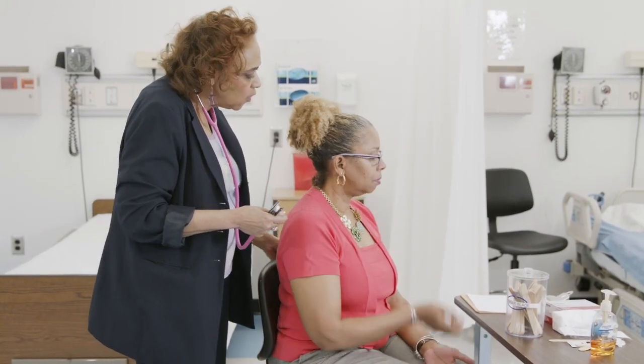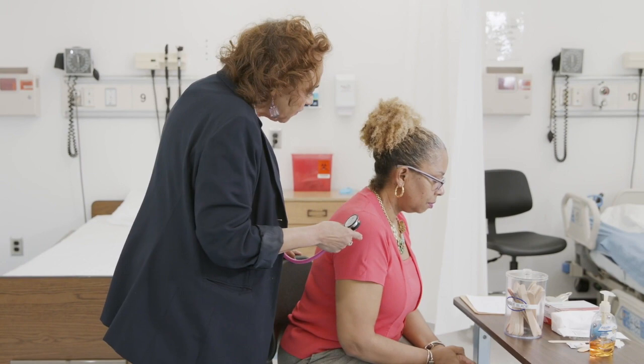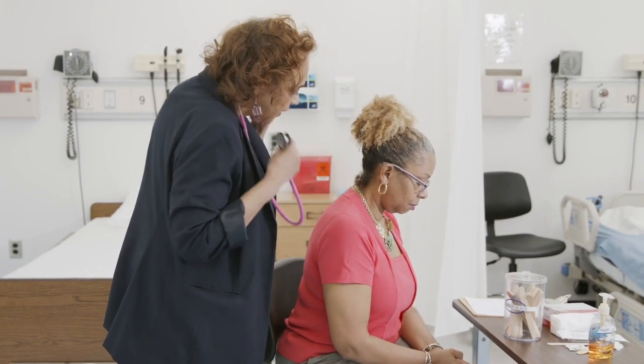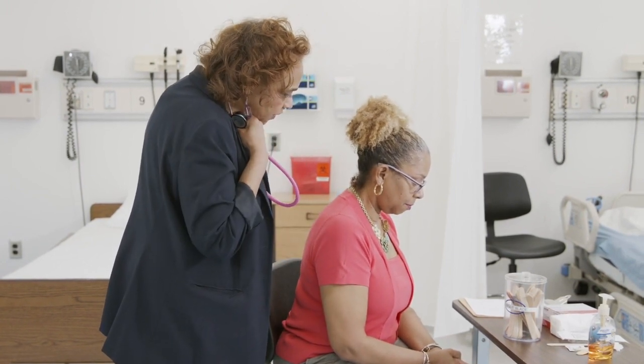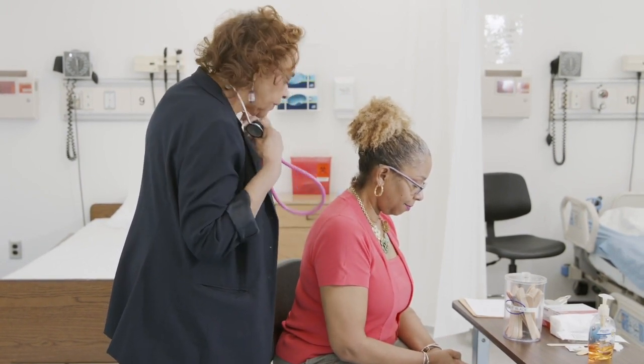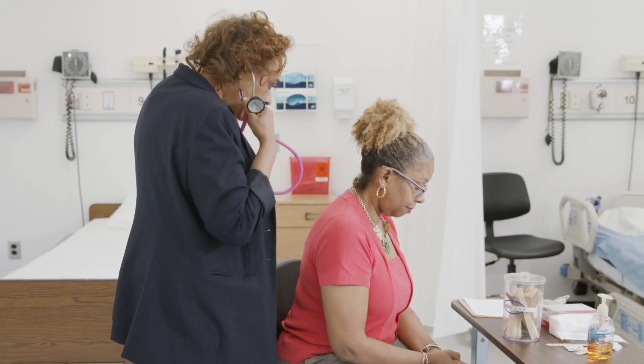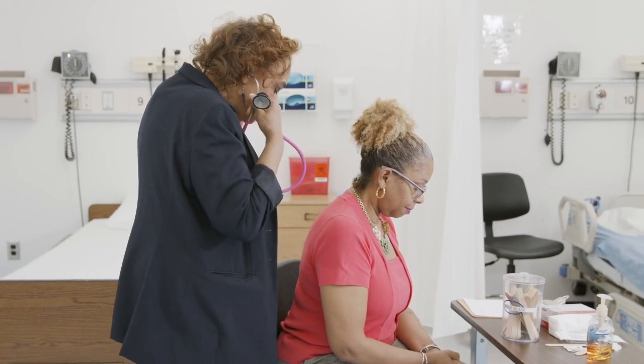And then you will have the patient lean forward and you will then listen to the back. Ask the patient again to take deep breaths as you listen as they inhale and exhale in each area.